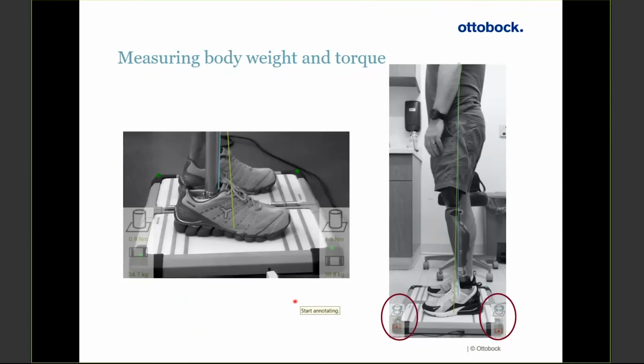So I think this is really great because it's not often that we have our patients standing in their device and for us to truly know how much weight they're putting through. So this can be an indication. Are they having socket pain, or are the trim lines of my orthosis causing me not to load my device? Is my prosthesis too long or too short? Other things that can be an indication of not loading their body weight through it. So, for example, they don't feel safe.